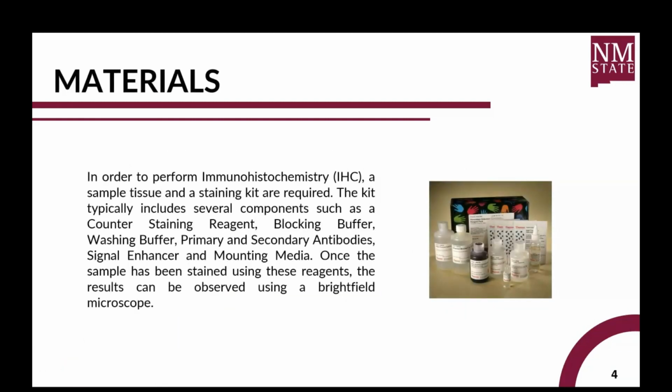In order to perform immunohistochemistry, or IHC, a sample, tissue, and staining kit are usually required. Kits usually include the same components all around.